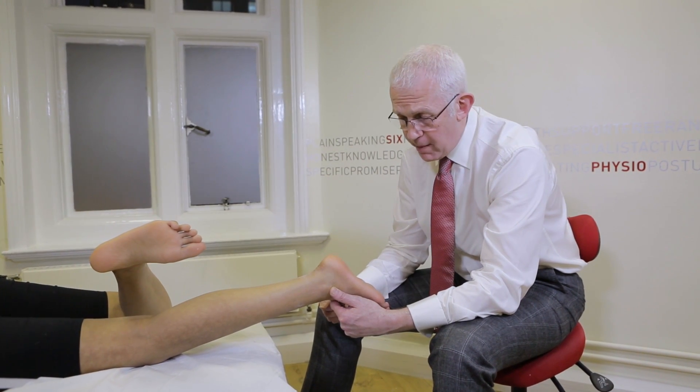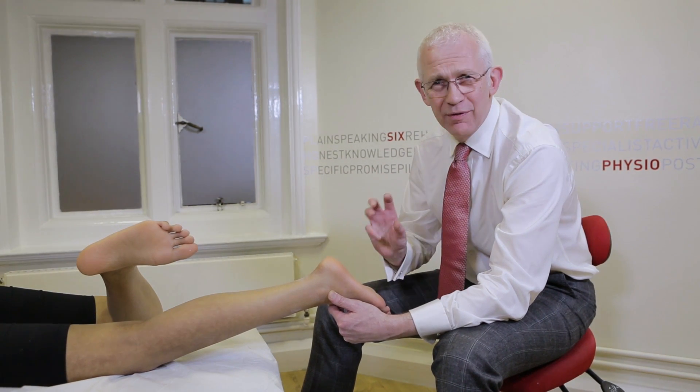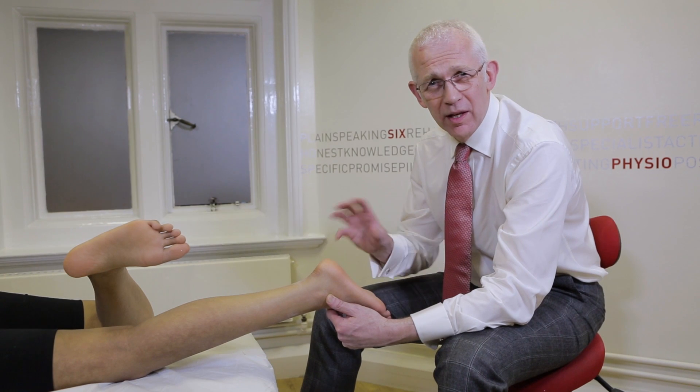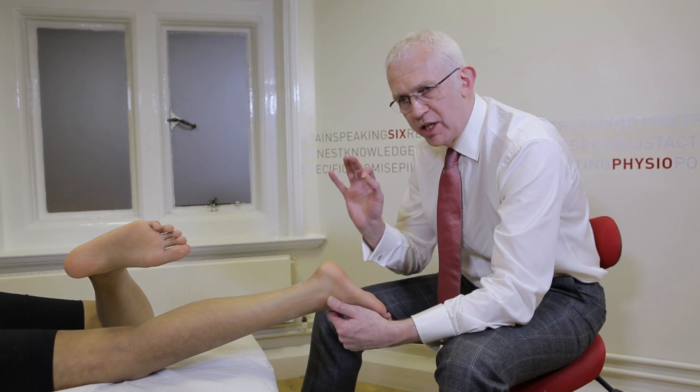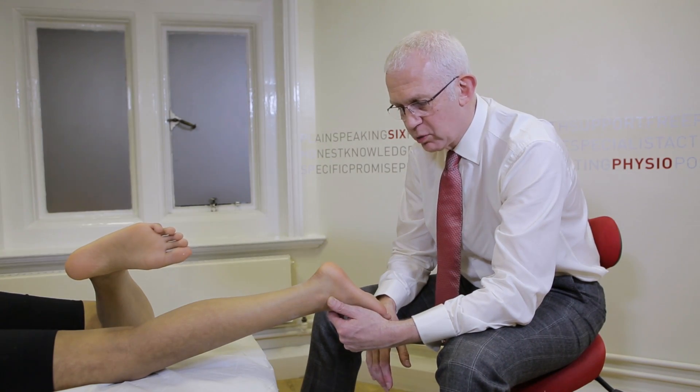In some orthoses like PodFo, they have a progressive flex, which is where the flexibility of the device changes between the thickness of it. So you can have rigid in one point and flexible in another point, giving you a bit more variation in how the orthosis works.